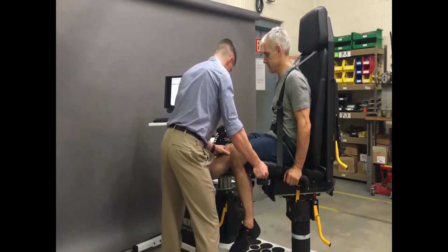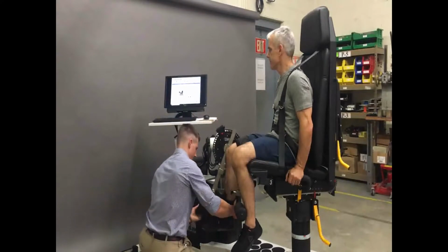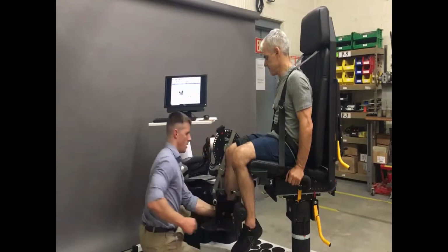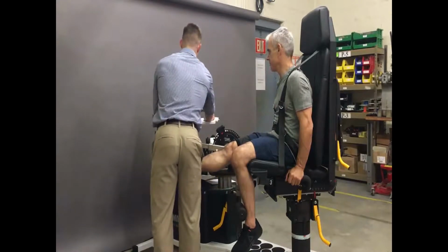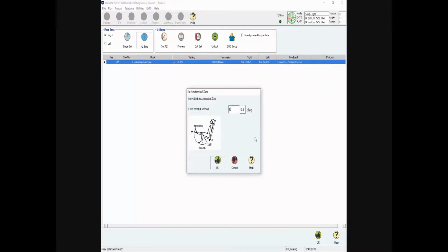Another question that's been brought to me lately is, what happens if they pass the slower speed but not the faster speed? Does that matter as much? And in my opinion, and this is just my opinion, no, it doesn't. That faster speed, when I do use it, I'm looking more at the fatigue that they get over those 15 reps. Now, the problem with the fatigue index is it measures the first 3 reps and how it compares to the last 3 reps out of 15.